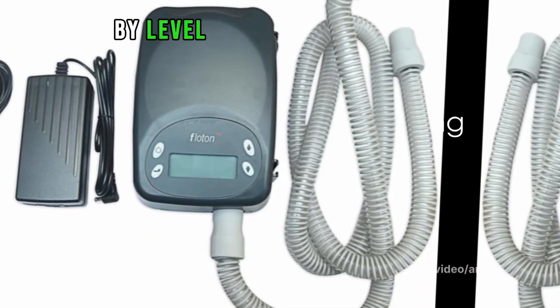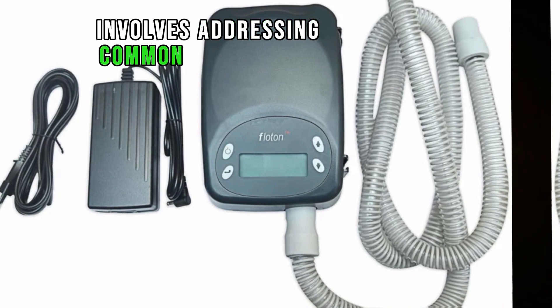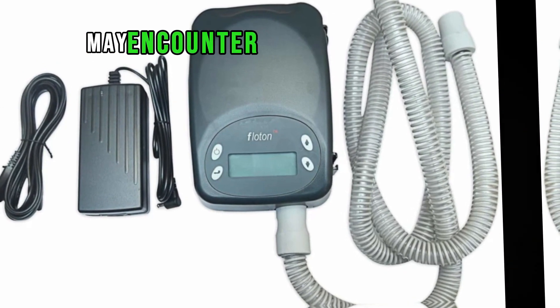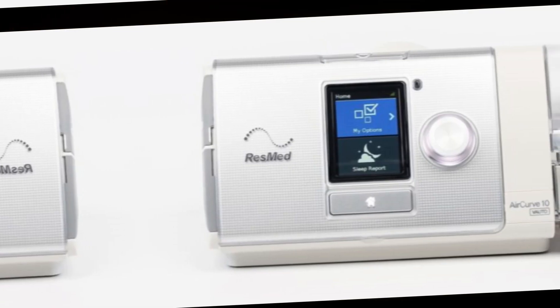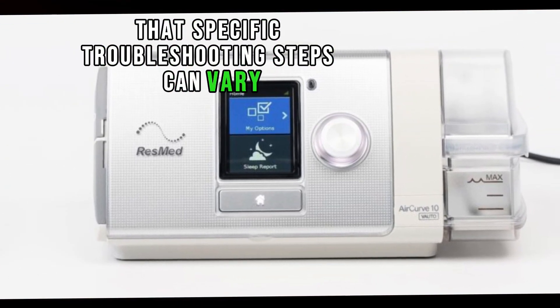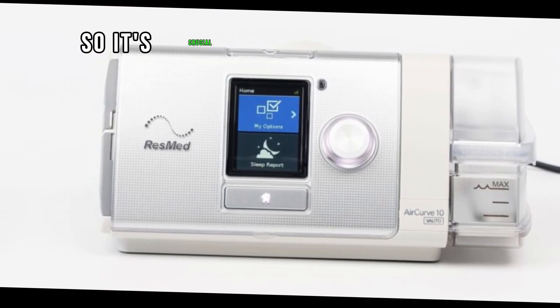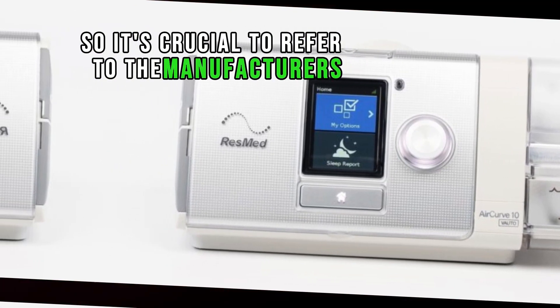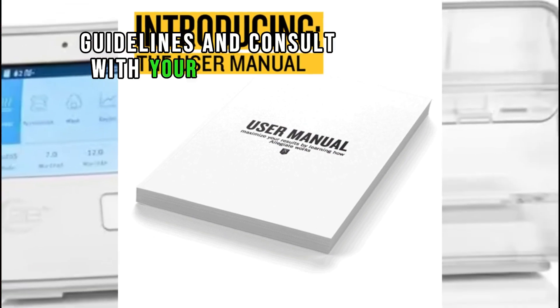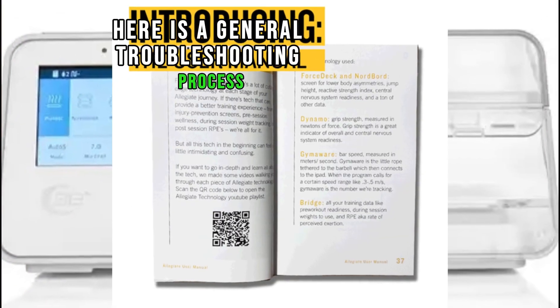Troubleshooting a BiPAP — Bi-Level Positive Airway Pressure — machine involves addressing common issues that users may encounter during its operation. Keep in mind that specific troubleshooting steps can vary based on the brand and model of the machine, so it's crucial to refer to the manufacturer's guidelines and consult with your healthcare provider if needed. Here is a general troubleshooting process.